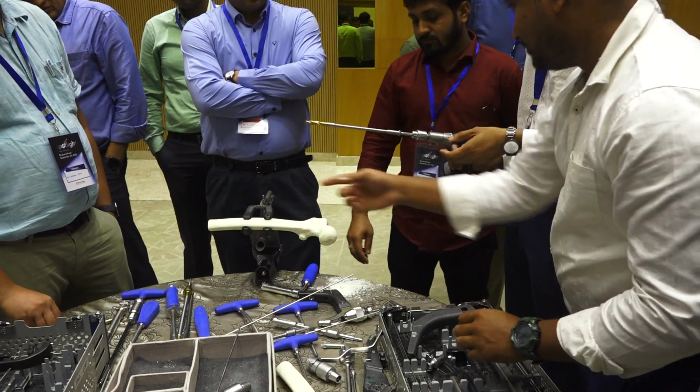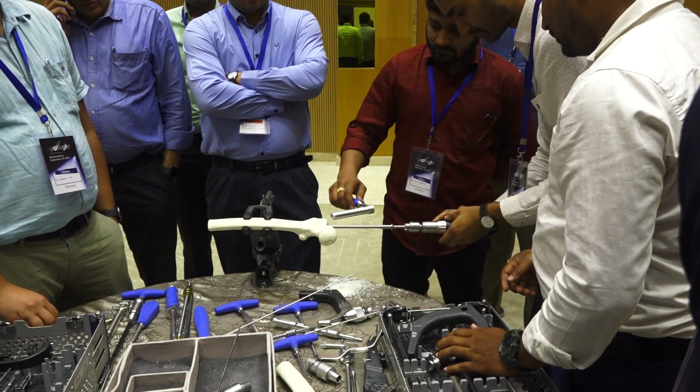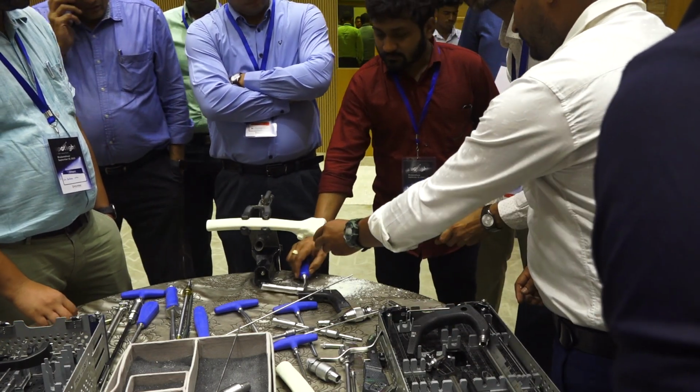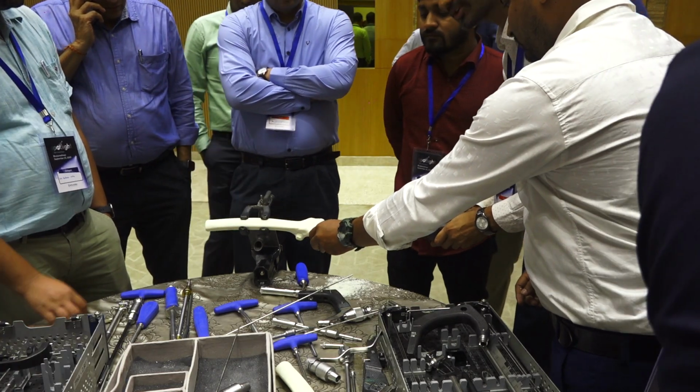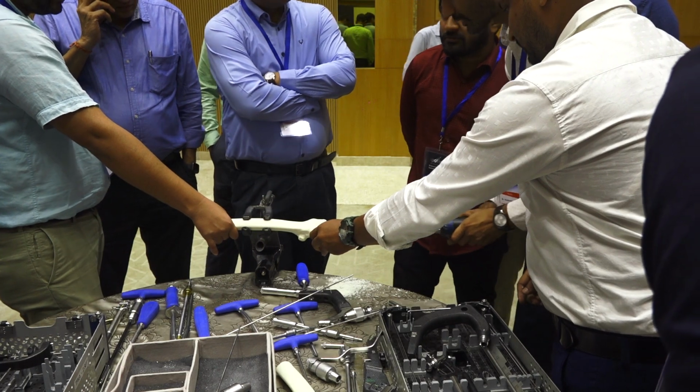It also depends upon the fracture morphology. If the fracture is unstable, we should always go for a longer nail. In a subtrochanteric or unstable fracture, it is always better to put a longer nail.